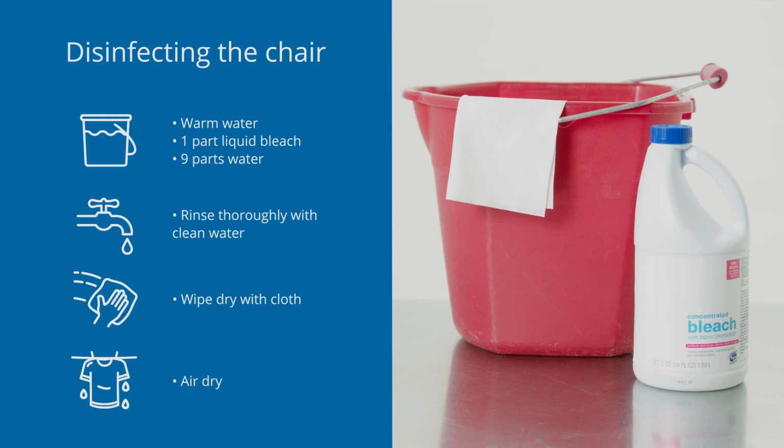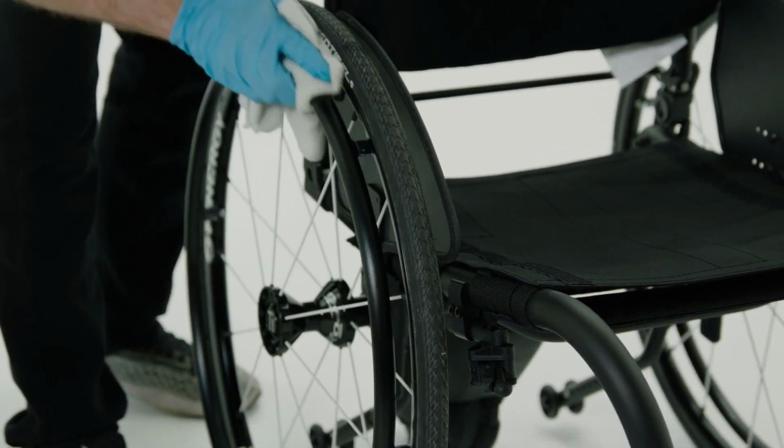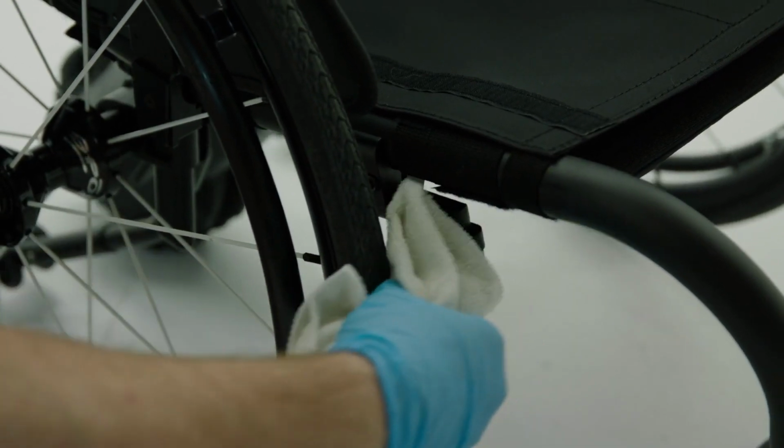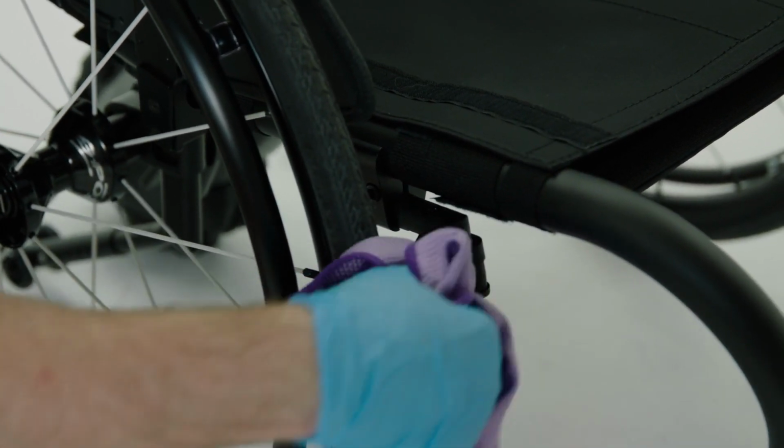To disinfect, moisten a soft clean cloth with a mixture of 1 part household liquid bleach to 9 parts water. Wipe your frame and components. Give special attention to components that receive frequent touching, like hand rims, push handles, and wheel locks. Immediately dry all components and other parts of the chair that have become wet.